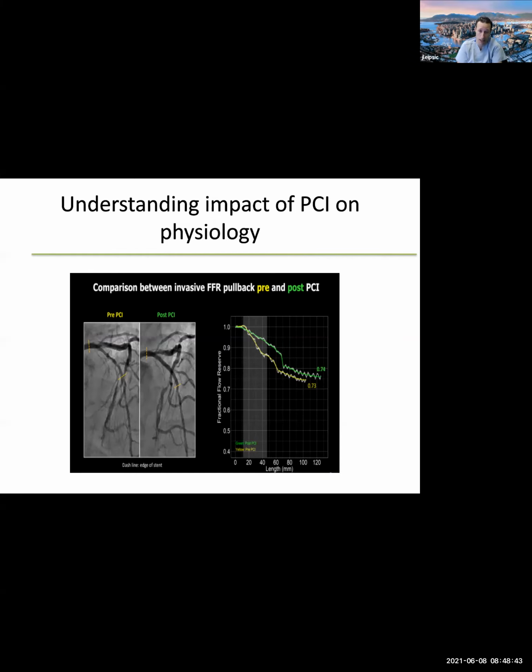We've seen that in CONFIRM, right? There's a dose relationship between the extent of plaque and risk. And so I think that's obviously very important to keep in mind. In the new CAD-RADS, it will actually include a descriptor based on the extent of plaque. So there'll be 3 levels. I forget what was settled on there. I'm not focusing on the plaque element, but I think it's mild, moderate, and severe burden of plaque, because we know that's important. The other element that's important, of course, is if the plaque is premature.